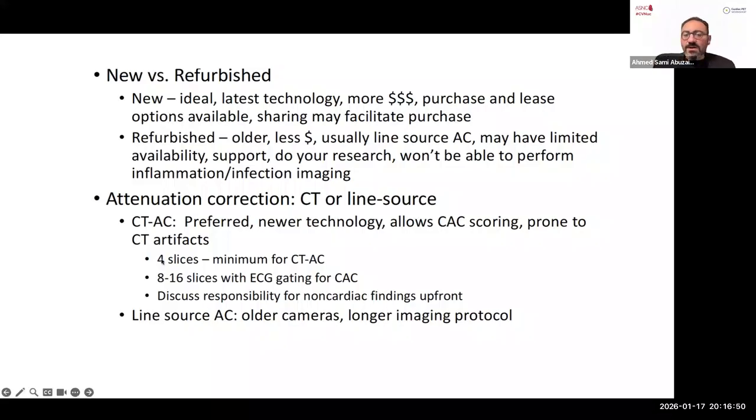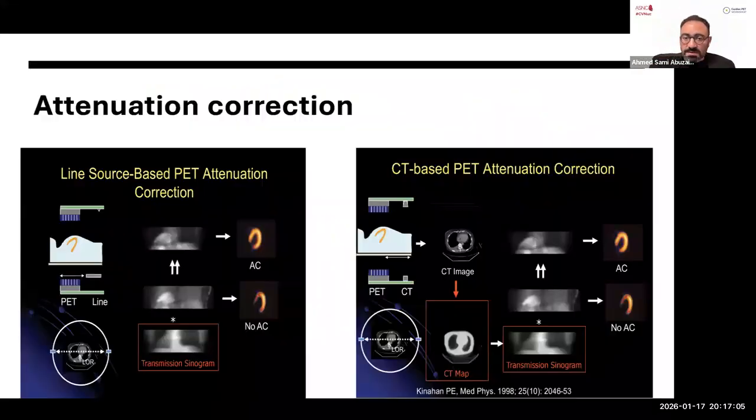And we need a little bit of slices. We need at least a minimum of 4. I think the lowest one I worked on was 16, and that was okay to give us a visual qualitative assessment, just mild, moderate to severe coronary calcification, and that is important.